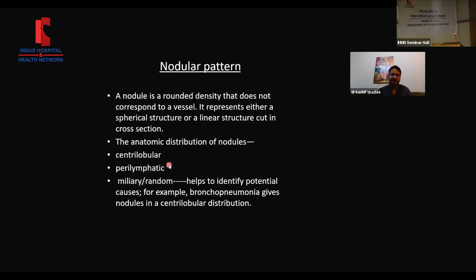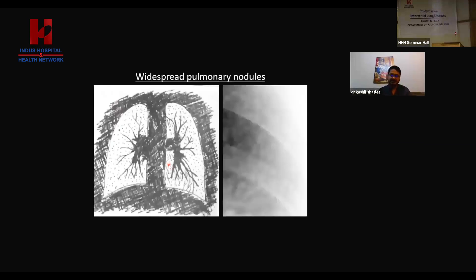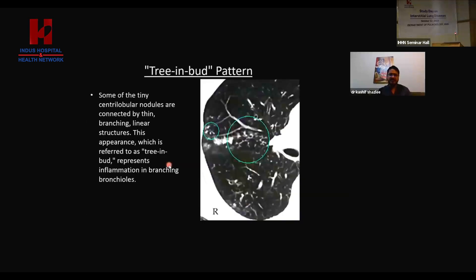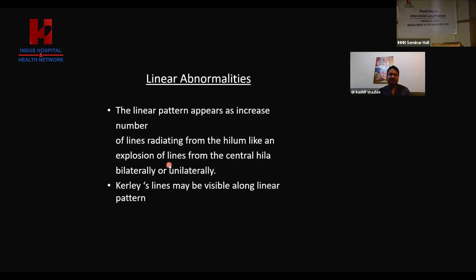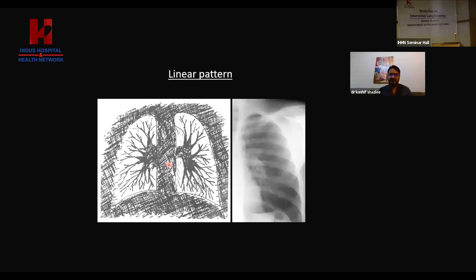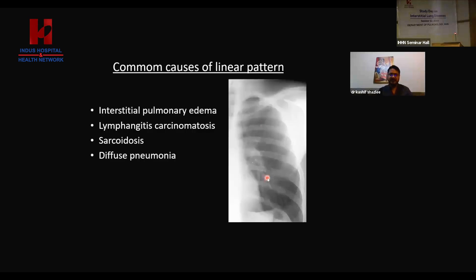Nodular pattern is well known, with different types: the miliary pattern, micro nodularity, scattered nodularity, etc. There are common causes of nodules. Tree-in-bud appearance is very famous. Linear abnormality or linear pattern usually appears due to engorged interlobular septa or engorged peribronchovascular interstitium, appearing from central to peripheral, and sometimes from peripheral to center like Kerley line B, Kerley line A, Kerley line C — all linear patterns.